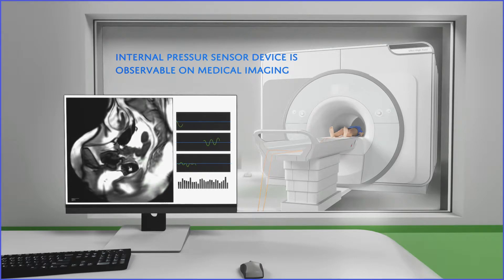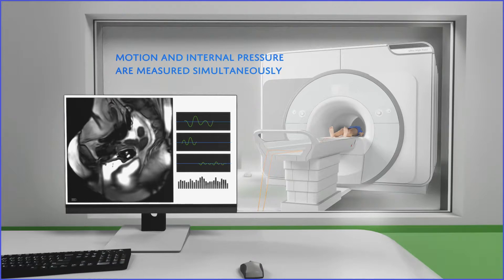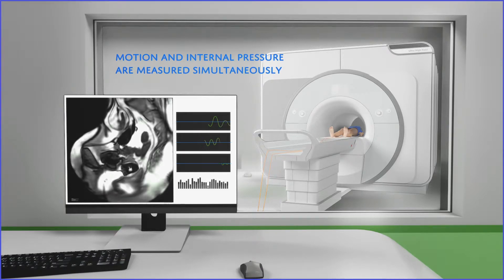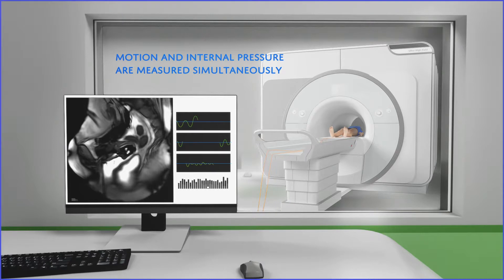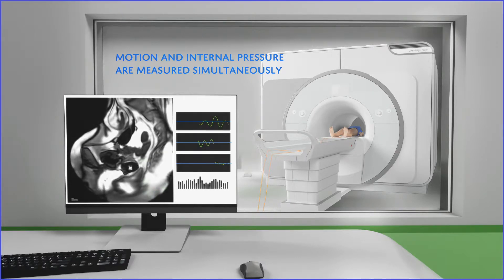During the medical exam, without disturbing it, the pressure sensor measures the intra-pelvic and abdominal pressure while patient is breathing or coughing. As observed on the screen in the radio room operators, the acquisition is performed in real time.